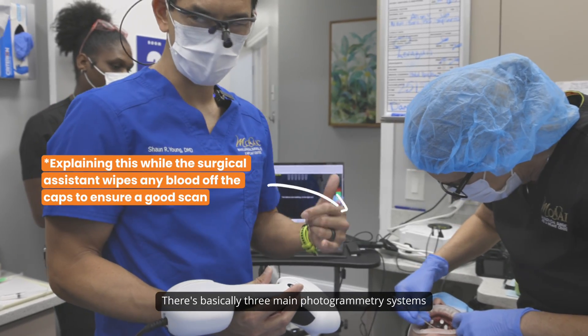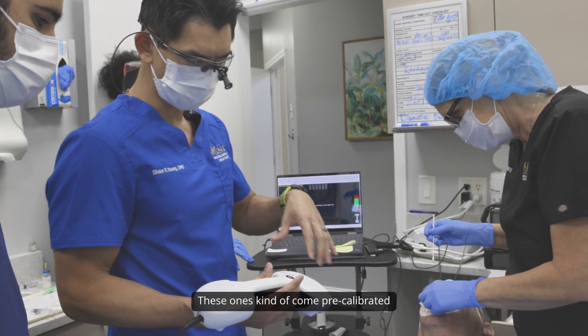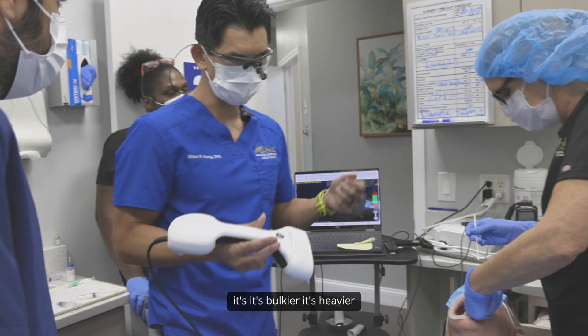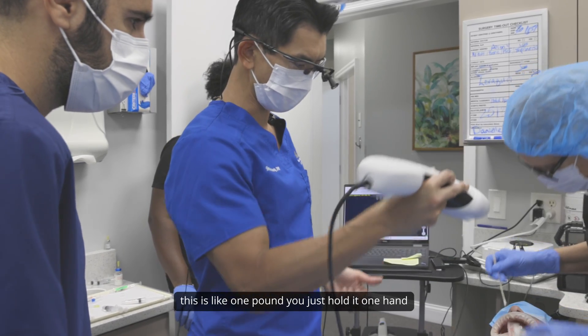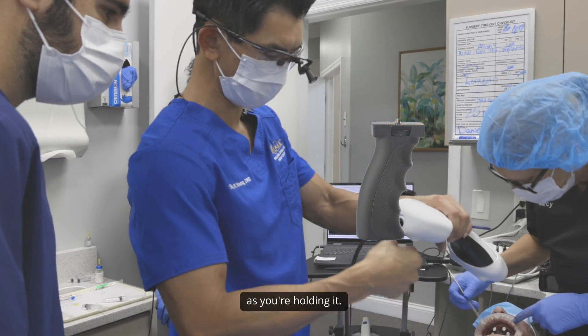There are basically three main photogrammetry systems. This is the Micron Mapper. These come pre-calibrated. Some of the other systems are bulkier and heavier — you have to calibrate them every time and hold with two hands because they're so heavy. This is about one pound. You just hold it in one hand, and there's even a handle you can attach to it.